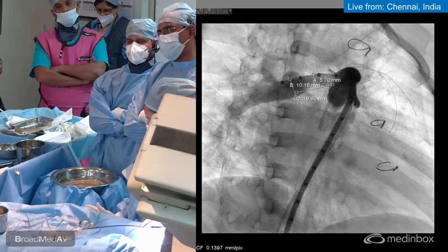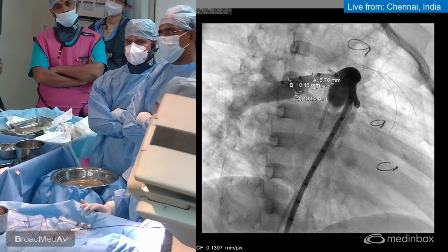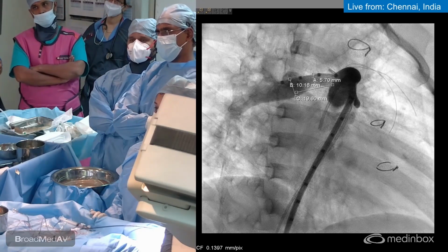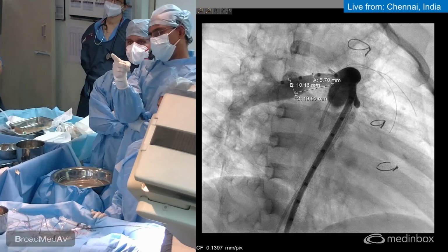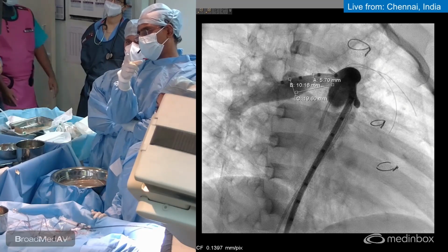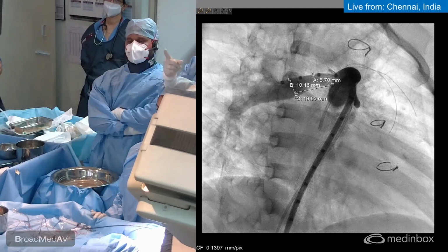Now, in this particular patient, if you look at the anatomy, the hilar right pulmonary artery was measuring around 10, and even though the measurement is 19.6, I feel it's not correct because the marker itself is running 3 centimeters. Yes, sir.